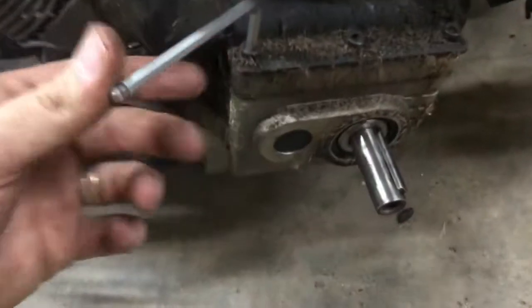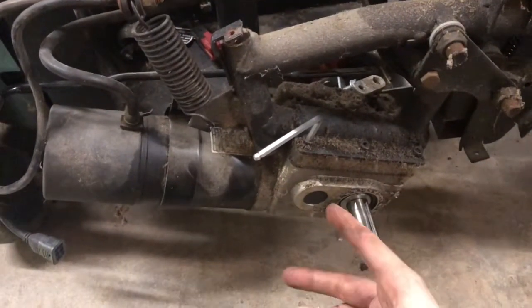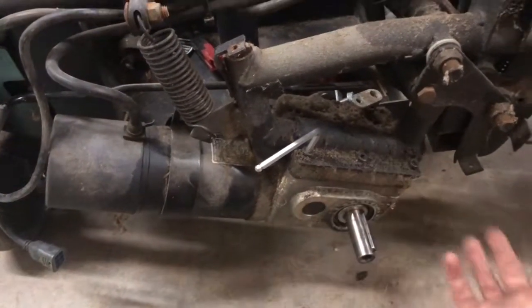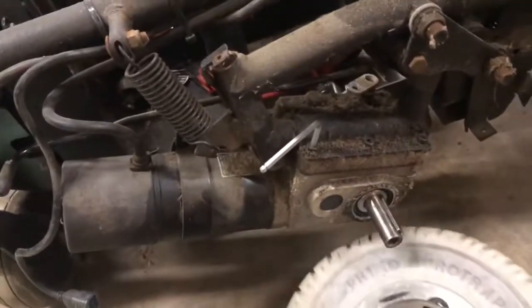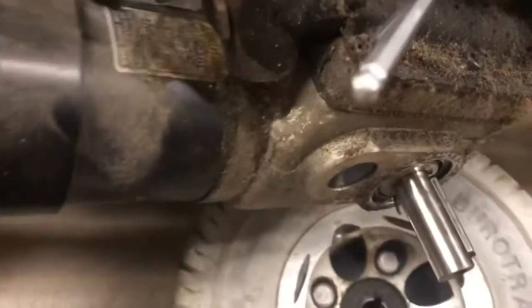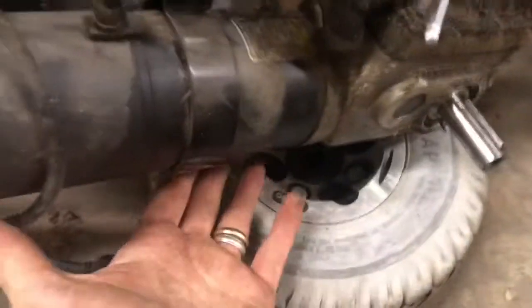If this motor is bad and you're replacing it, it doesn't necessarily matter if you ruin the threads in the motor. However, if you're taking your chair apart just to sell it, you want to make sure the threads don't get damaged in the process. So what you can do is lift the chair up a little bit and set it on the tire that you just took off. You may want to set something else under here. So let's go ahead and I'll just grab something here. This will work.